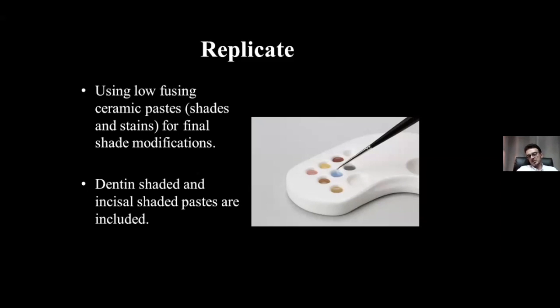This is just the background of all the color shapes we are going to draw to produce a natural looking restoration. So what we are going to use is something that has been on the market for several years now. It's what we call a 3D luster paste, 3-dimension, not 2-dimension. It differs from the regular stains we know. The regular stains are 2-dimension, meaning they don't allow the light to pass through them, so the third dimension, which is the depth, doesn't exist.